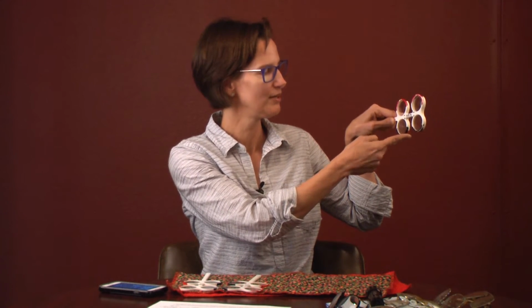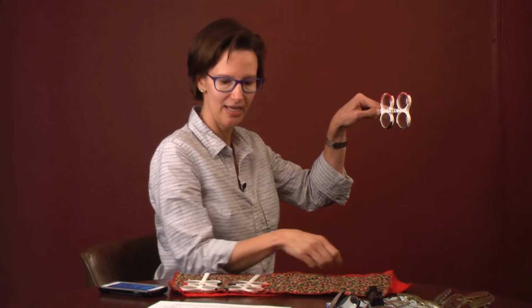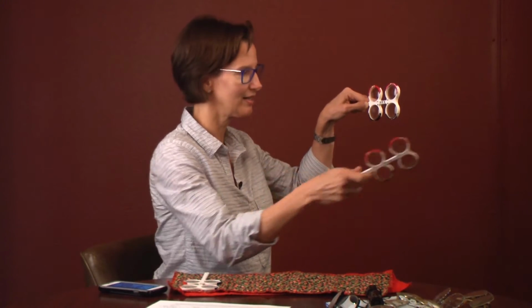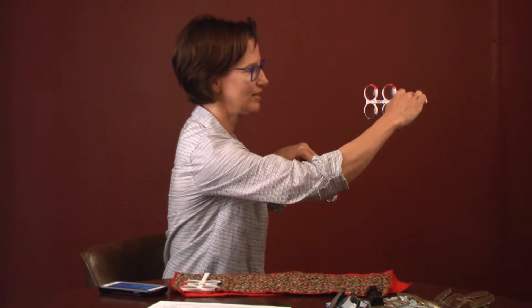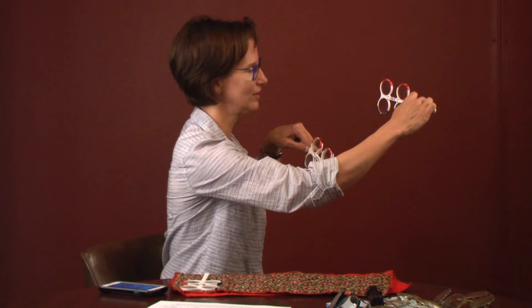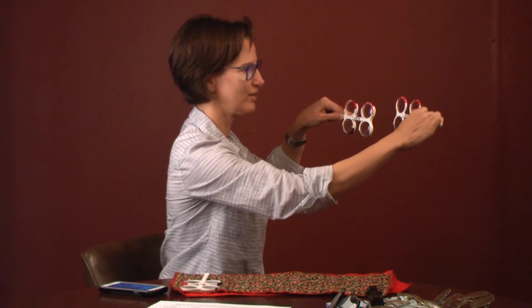If they like the plus 1.25 side better, then you're going to work up the plus scale. You're going to go higher and higher and higher. So what I would do is have them physically holding the plus 1.25, and then I would take the plus 2, which is black, and compare them. Better with 1 or with 2, or which is more clear? ¿Cuál es más claro? That's in Spanish. And you just go back and forth.